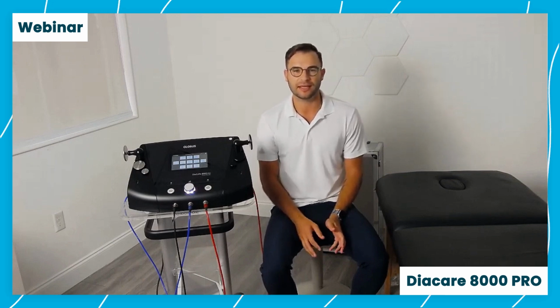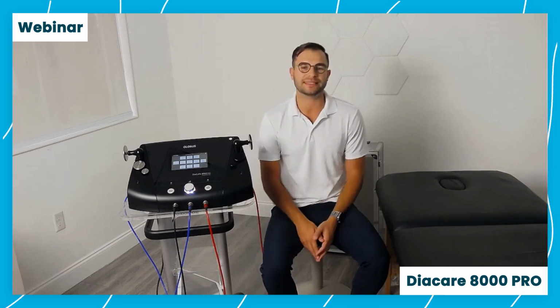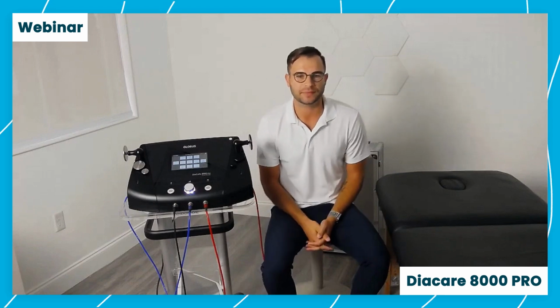It's important also to think about the intensity that the machine has, the amount of power that it's generating, and what stages of healing your patient is at, and what we're trying to deliver for that patient the best. And lastly, we're also going to be talking about the geography and how we are going to be placing not only the active electrode, but also the return plate that is going to be placed under your patient. This is also very important because we're trying to deliver all of the energy to the correct structures, okay?